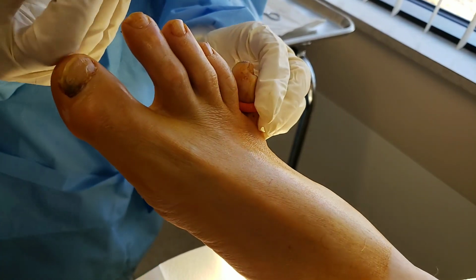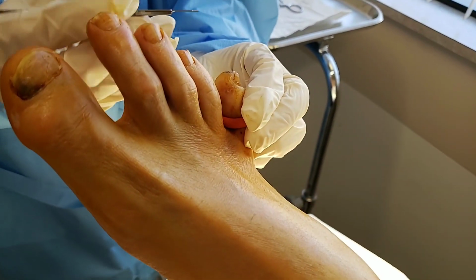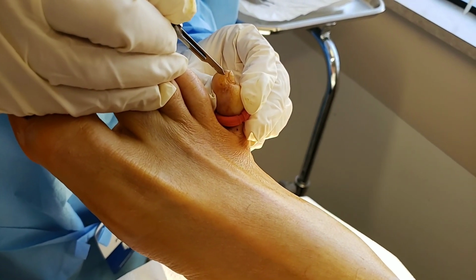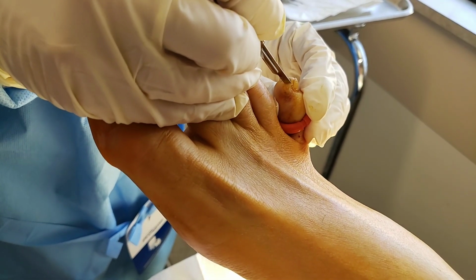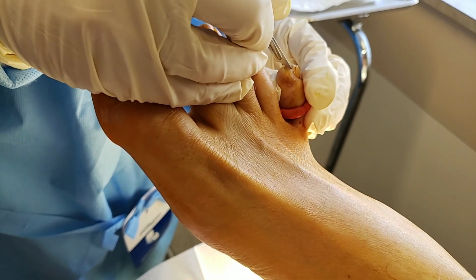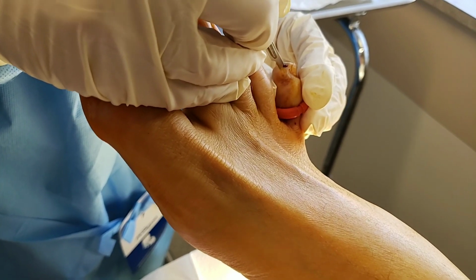One of the simple treatments is to trim down that callus there. But because it keeps coming back, what I do is I make a little puncture here. And we have this little orange thing on the tip. Any pain? Nope. And you go right down to the bone. I can feel the bone.